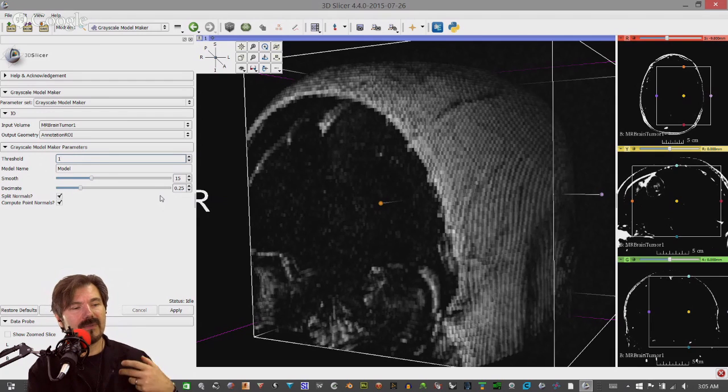So you have to think ahead of time, what do you want to print? Think of it as a shell. And anything that looks grayscale won't work. It essentially has to be there or it doesn't have to be there. So what I found that I've done and others have done is that they create multiple models, let's say of different grayscale levels, especially if they're different regions, and then they assemble them later on.